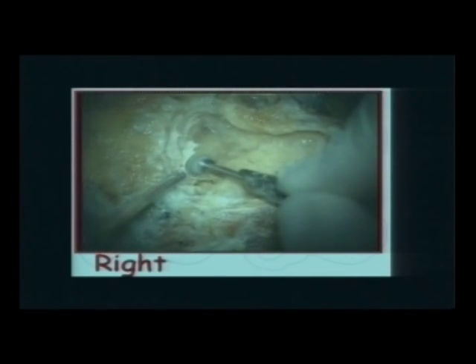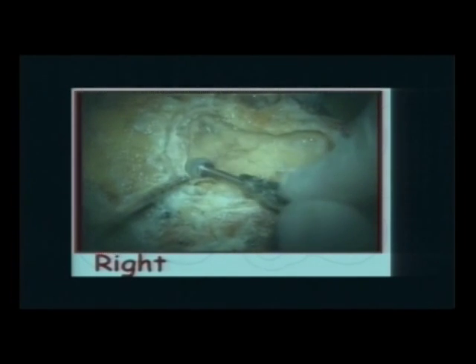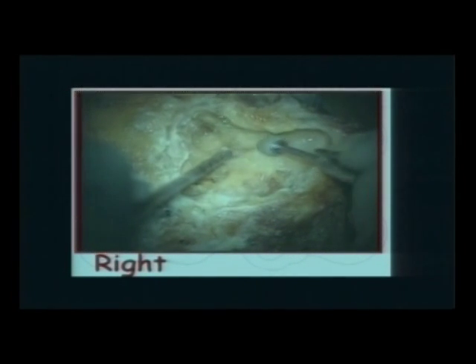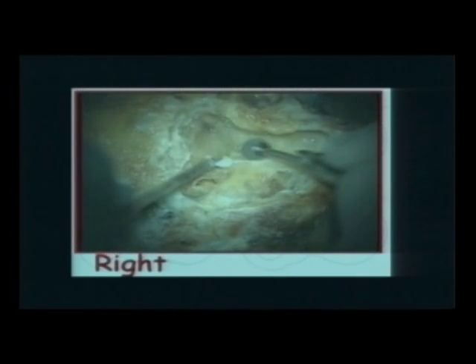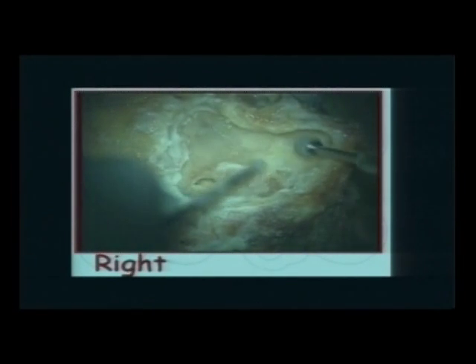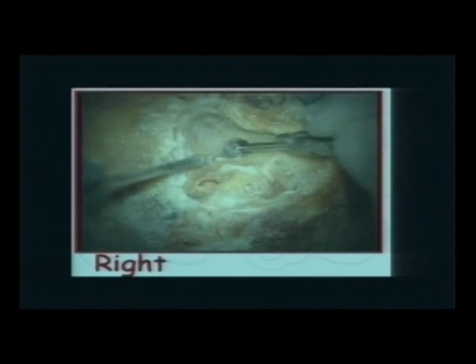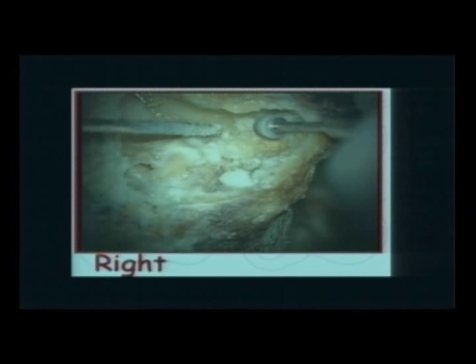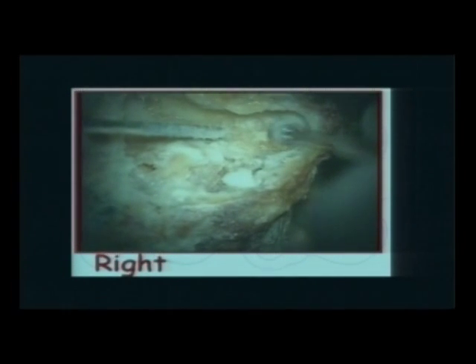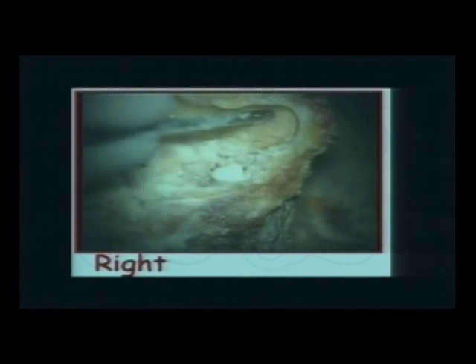And now we've opened the antrum, and if we suck, you can see the dome of the lateral canal right there. And something very nice, every time I suck, there's something white that appears with the water and disappears when I suck the water. This is the incus. This is the water sign of the incus. Something really nice that shows and appears inside the bone. It's because of refraction of the light, so you see the incus before you actually see it. You see it through the water first.